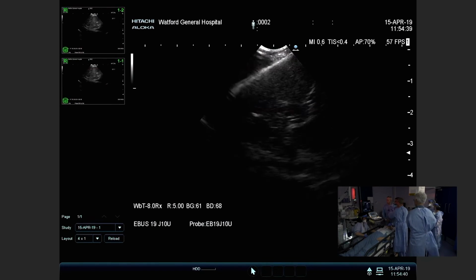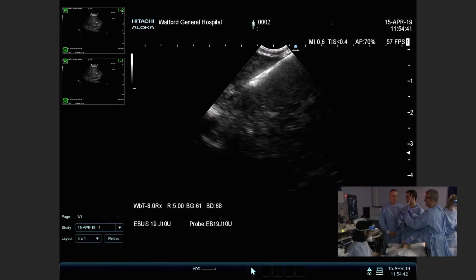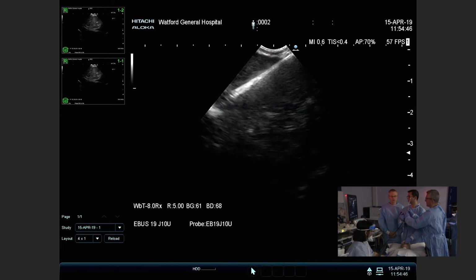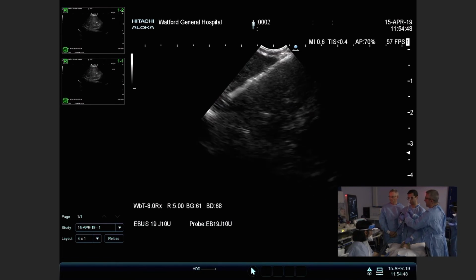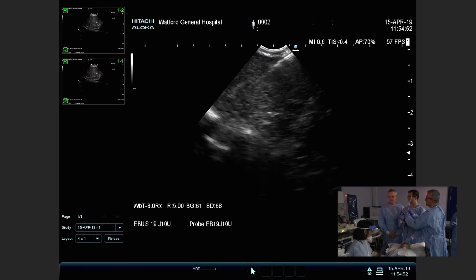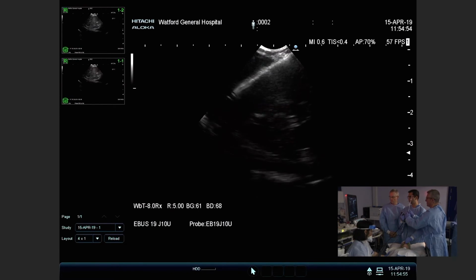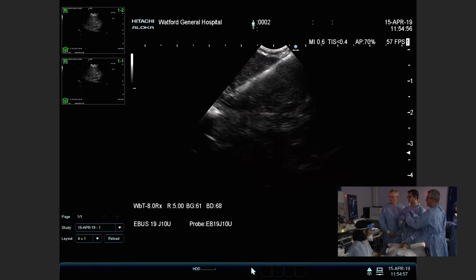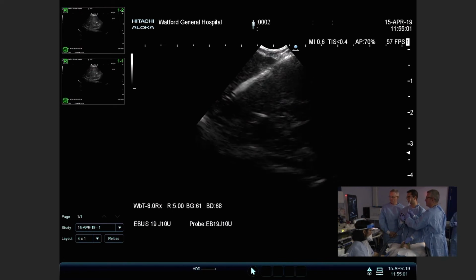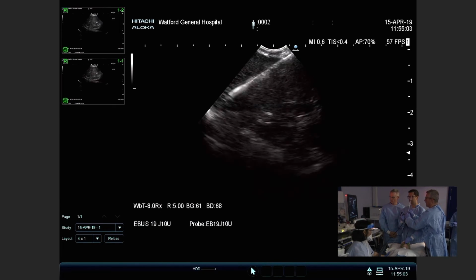Okay, so that's where we've gone back. That's where you are now. And that's the benefit of rapid on-site evaluation. That's the beauty, especially where you have the node quality which borders on necrotic in places. You can go back and harvest from the site where you know you've got viable material. Yeah, no, that's fine. That's okay.